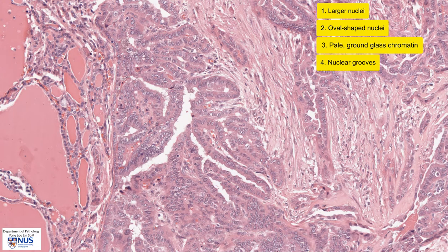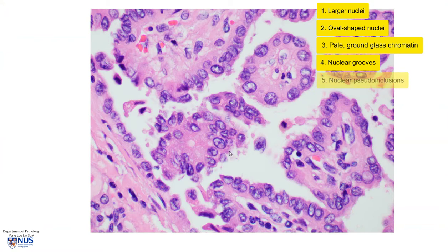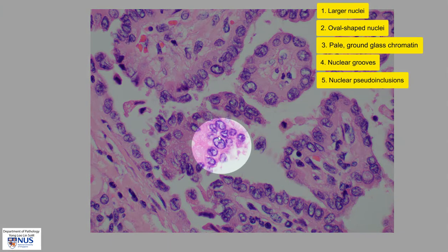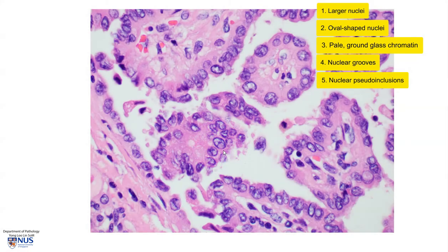Yet another nuclear feature is the presence of nuclear pseudoinclusions. Within this nucleus, we can see that there is a little island of cytoplasm which looks pink, the same as the cytoplasm of the cell. We see yet another nuclear pseudoinclusion within the nucleus, and another one here. These nuclear pseudoinclusions occur because of folding of the nuclear membranes — they tend to invaginate and fall inwards, and hence they appear to pick up a little island of cytoplasm.